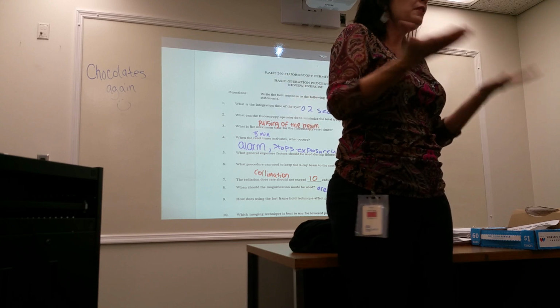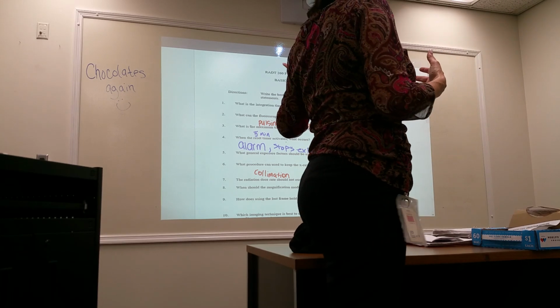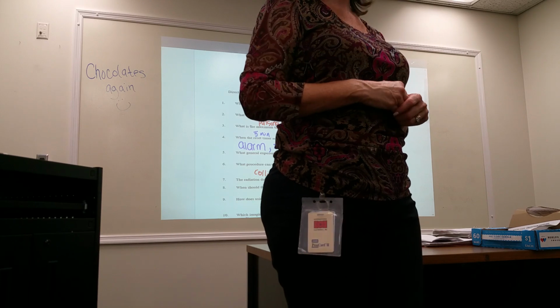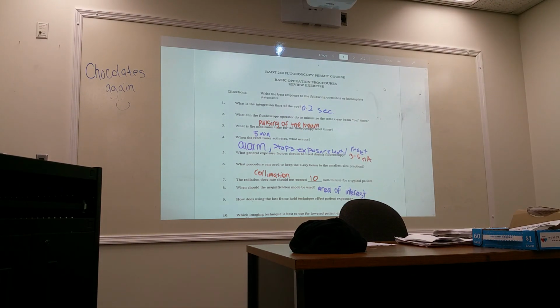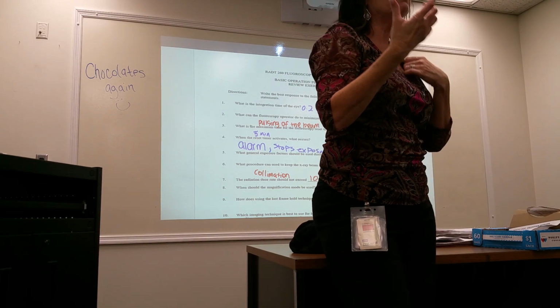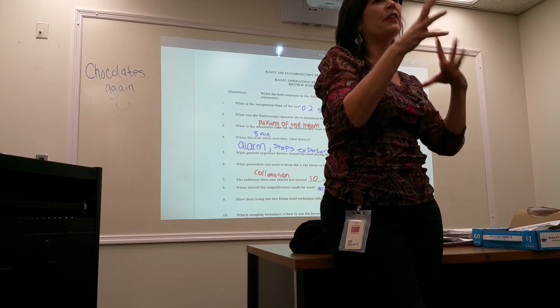That's quite a bit of a range. A typical dose rate for a typical patient in a fluoroscopic procedure is 5. Even though we can go up to 10, most of them are in and around 5 for a typical patient. So that's what made that question different, and we really haven't gone over that. I think you go over that next class, don't you? Yeah, so you'll get more on that later.